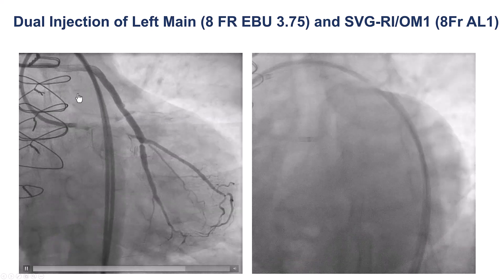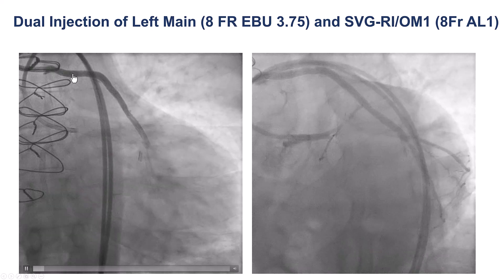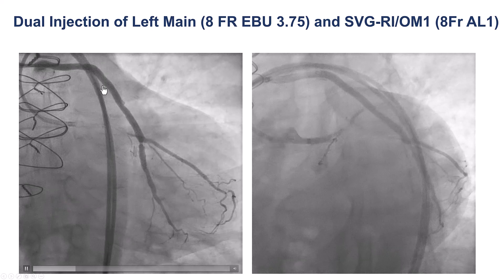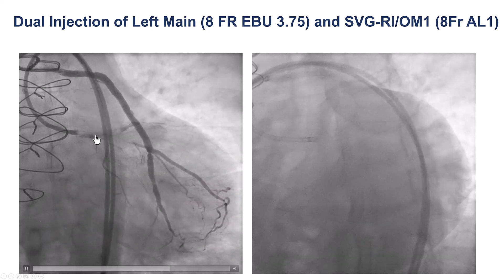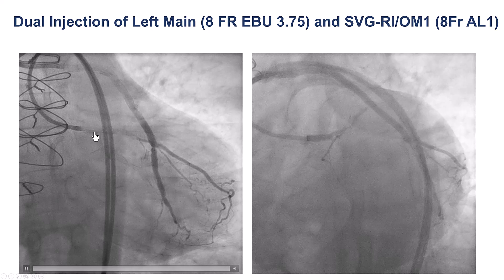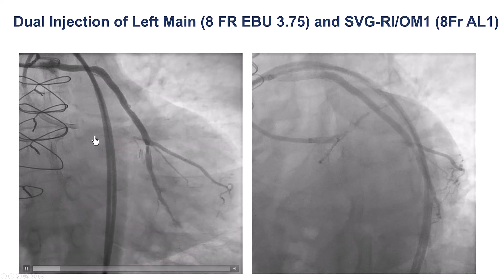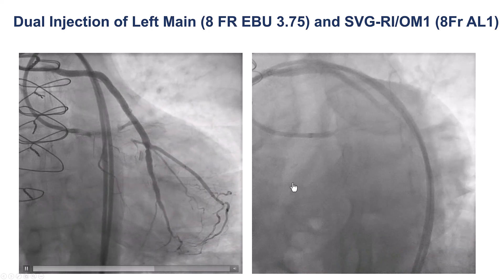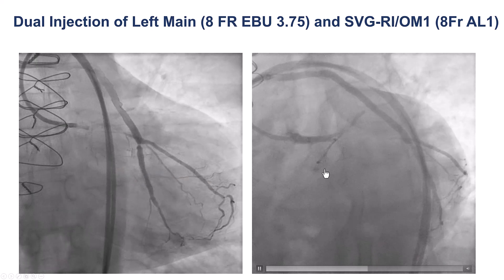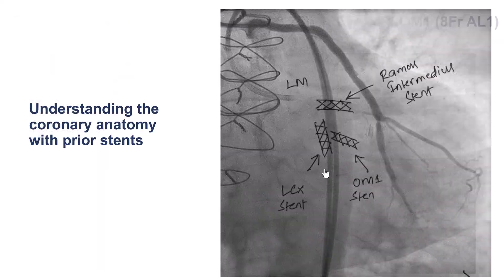This is the dual injection illustrating the anatomy. The vein graft is going to the RAMUS and OM1. We have a CTO in the proximal circumflex with previous stents there, and previous stents into the RAMUS branch as well. So, two CTO lesions and multiple previous stents in the RAMUS, circumflex, and first obtuse marginal branch.